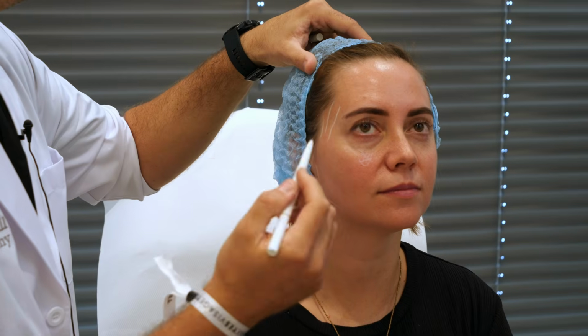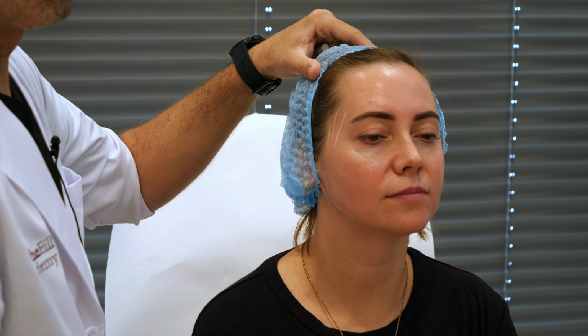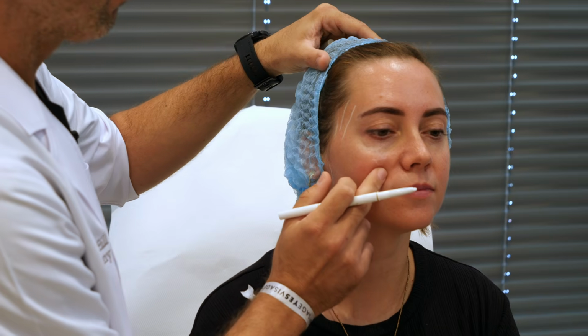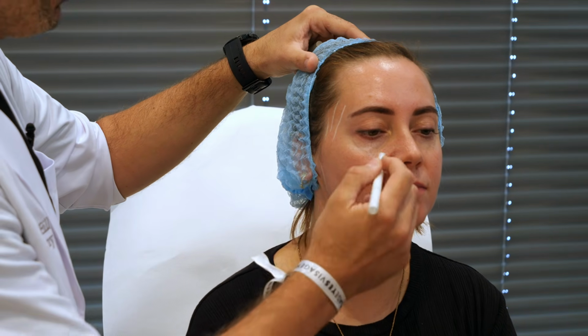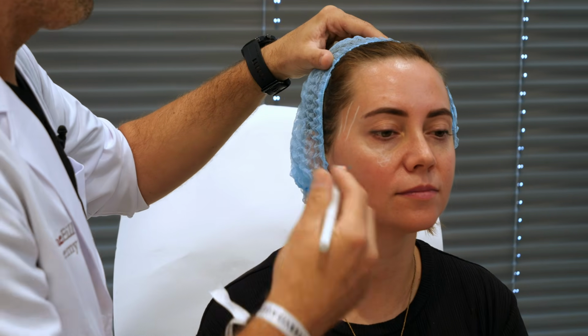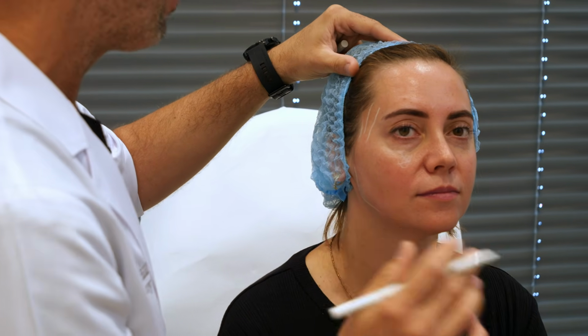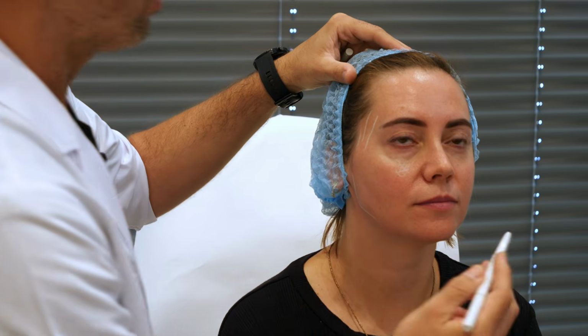And in the future, if she wants to treat the lacrimal circle, we need to reposition here. And we begin with the polylactic acid. In 2 months, we can see again, and we evaluate if hyaluronic acid here is necessary, okay?